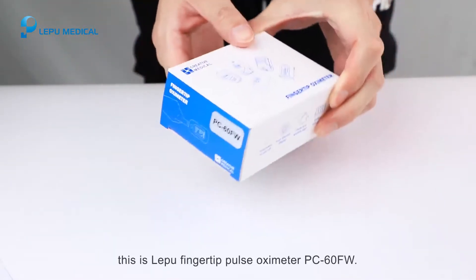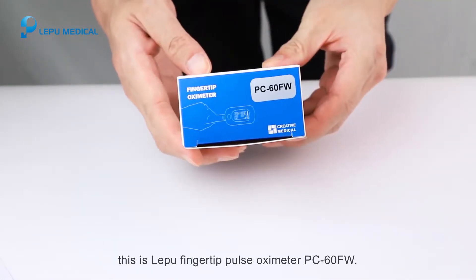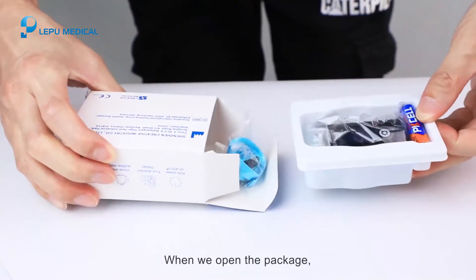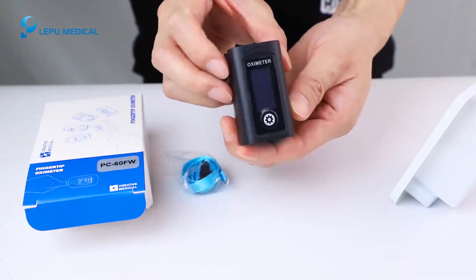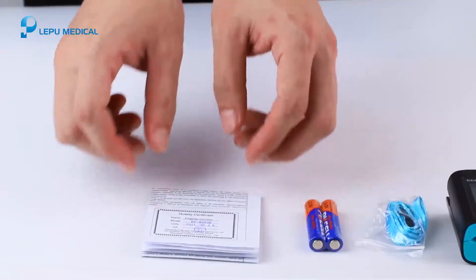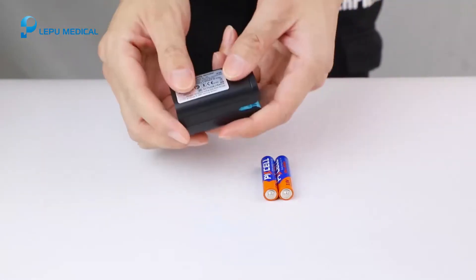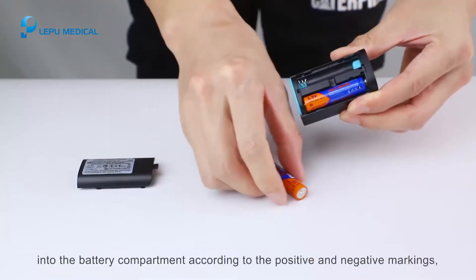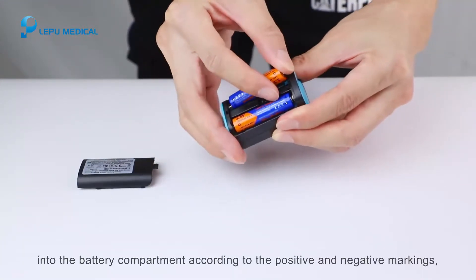This is the Lepu finger clip pulse oximeter PC60FW. When we open the package, there are the oximeter, battery, and lanyard. For battery installation, gently press two triple-A batteries into the battery compartment according to the positive and negative markings.